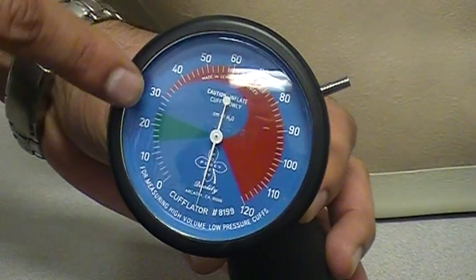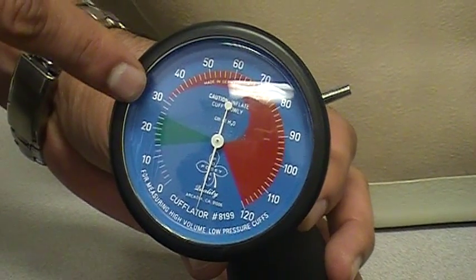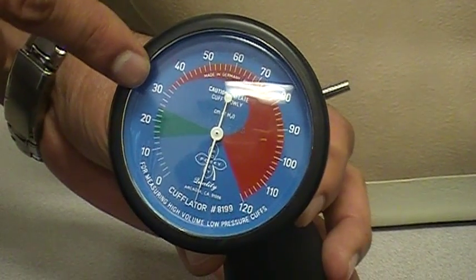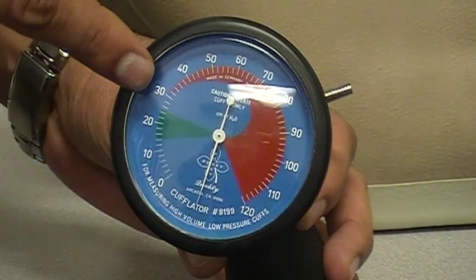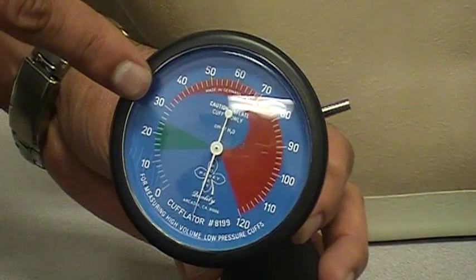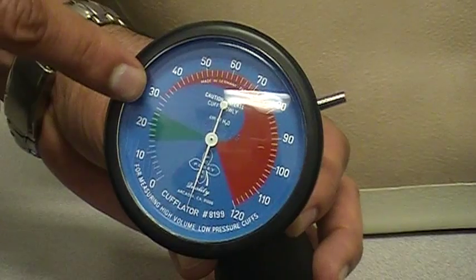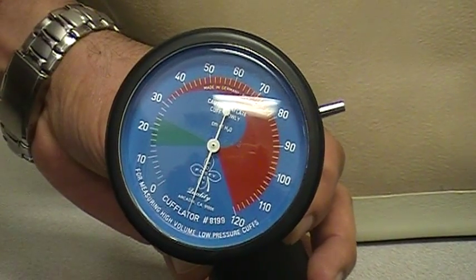We want to keep it somewhere over here in the green zone. Usually it's better if we keep it towards the higher end of the green zone, so even if you have a little bit of air leakage on the cuff, we are still safe. So we'll basically keep it in the upper side of the green zone.